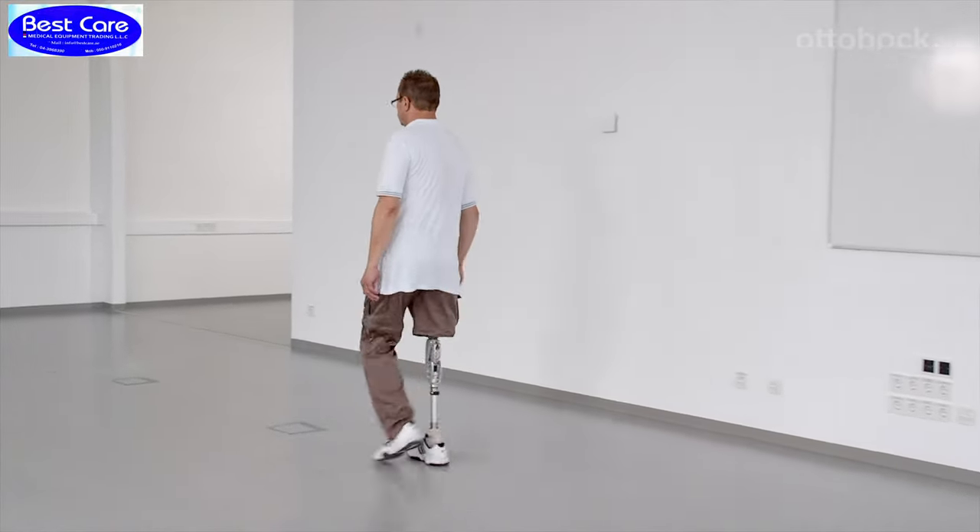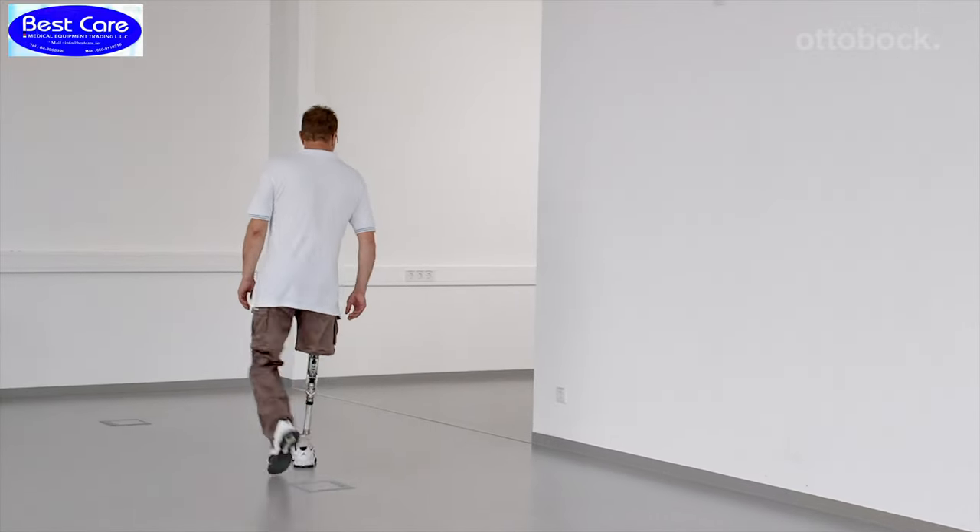Now the knee is set optimally for the end user and further walking exercises can be completed.